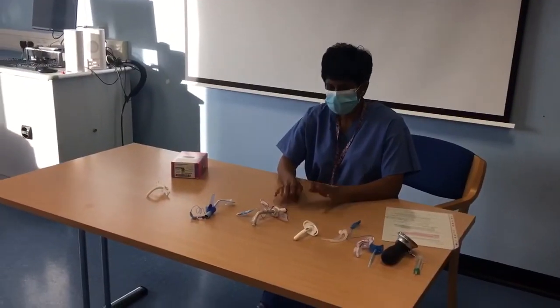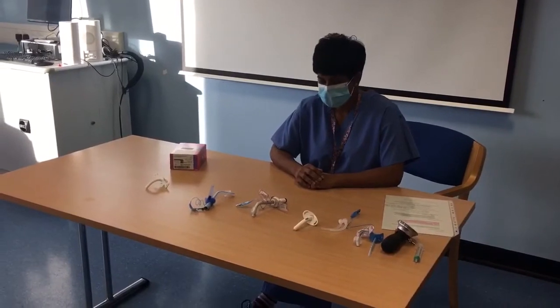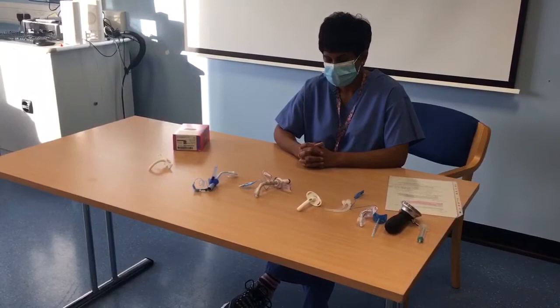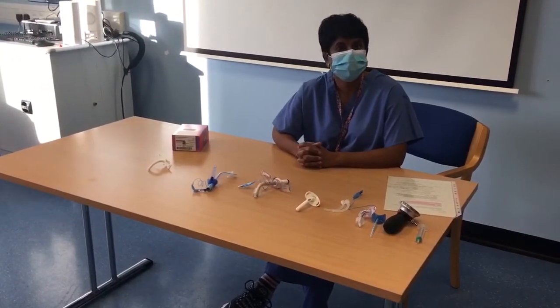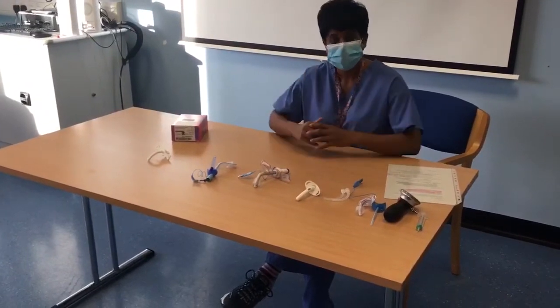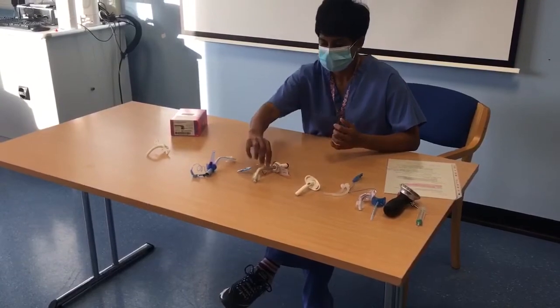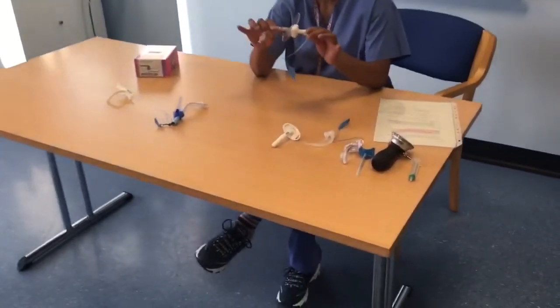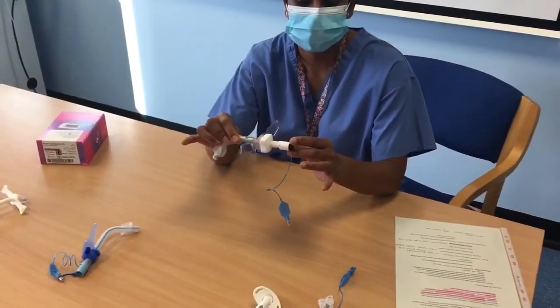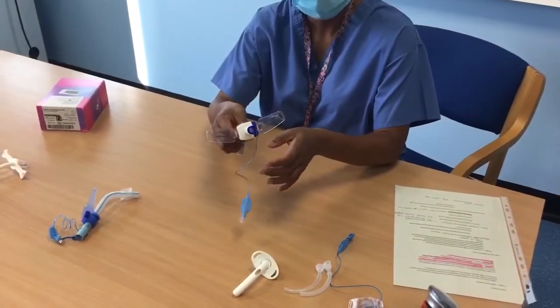Okay, next up we're going to have a look at our adjustable flange tracheostomy tubes. So these tubes would be used for patients who have had severe burns, or patients with larger necks, or patients who have suffered anaphylaxis. So we need to make sure that the length of the tracheostomy tube is adjustable as the patient improves.